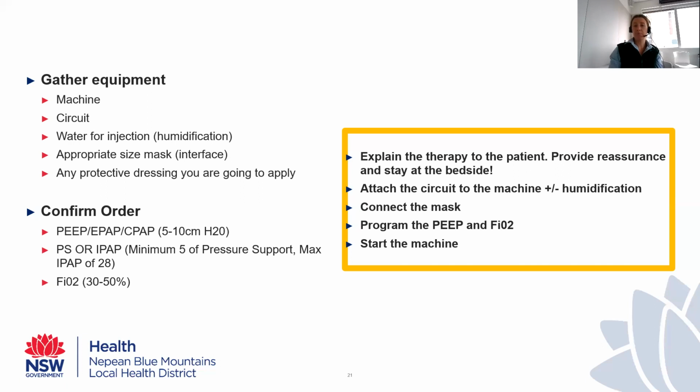You need to explain the therapy to the patient, provide reassurance, and stay at the bedside at least for the first little while that therapy has started. For some patients, that's only going to be 5 or 10 breaths. For other patients, that might be 15 or 20 minutes. Different patients require different levels of support and reassurance. You want to attach the circuit to the machine, plus your humidification, and connect your mask to the end of the circuit. You want to program your machine and you want to start it.